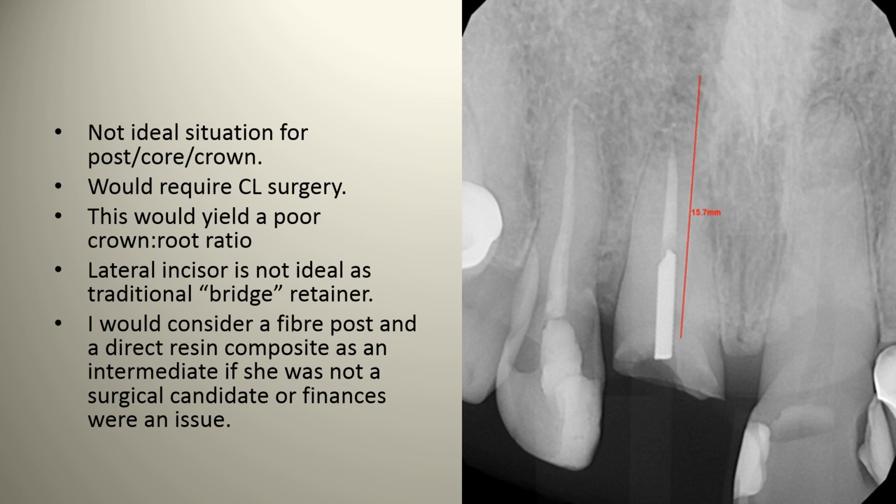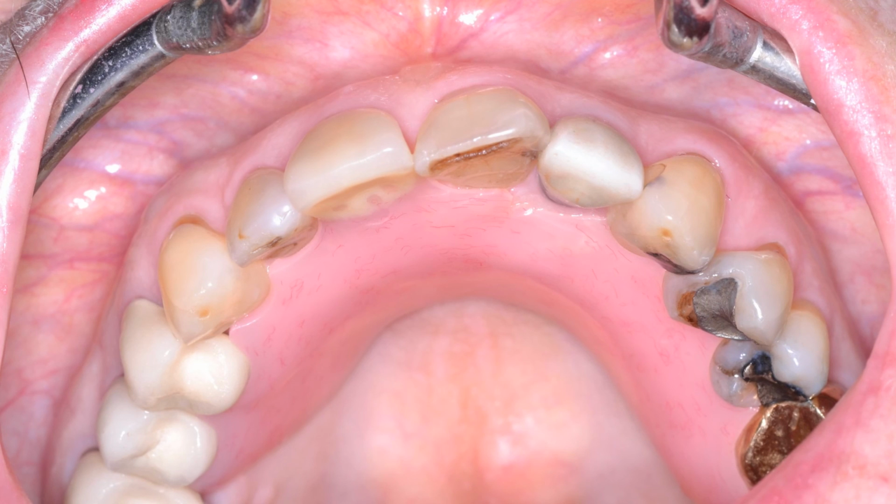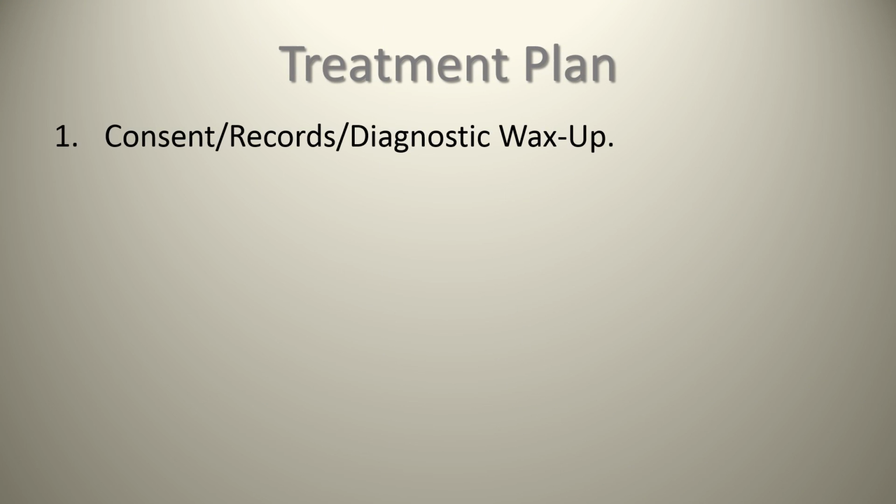But in this particular patient's case, she came in to see us because she wanted to get rid of this, what you see in this next picture here, this removable flipper, and get something which is going to be fixed. So the treatment plan for this lady was to go through the process of consent, getting the proper records, diagnosis, wax up, that sort of stuff, putting her to some sort of standard of treatment, and making sure all the teeth, caries, periodontal disease, all that stuff has been treated.